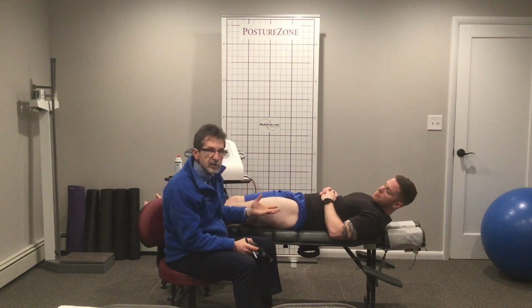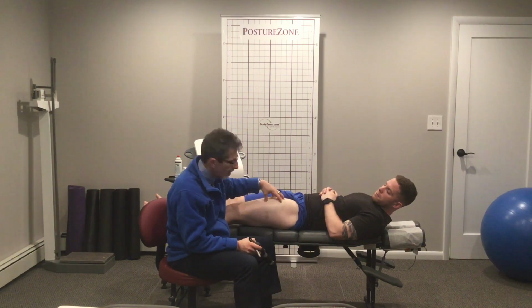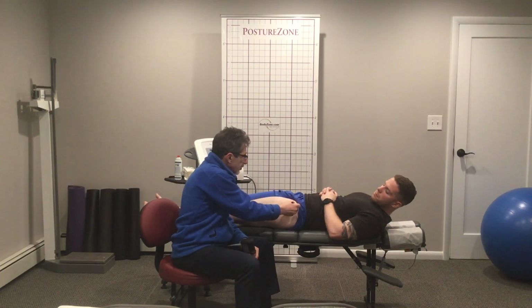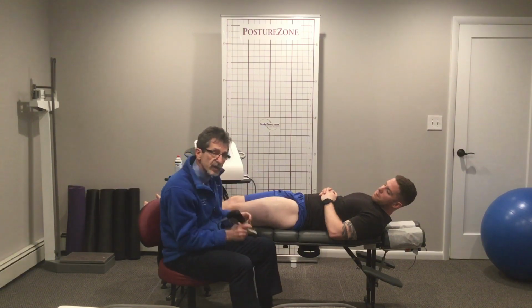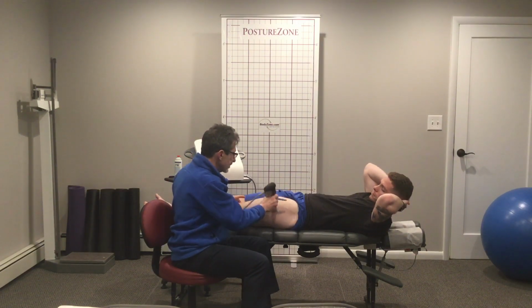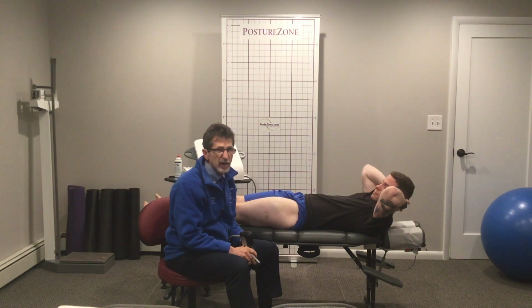So, how many hits? 2,000 hits around the lesion. It's a really big muscle. I may do 2,000 hits in this area and then go do maybe 1,000 or 2,000 up at the proximal and distal attachments. Remember, when you get close to the bones, back off on the intensity and the frequency, or come in on angles. When you have those deeper tissues, you can get a little bit more aggressive. Going to be sore for a day or two after you get done.